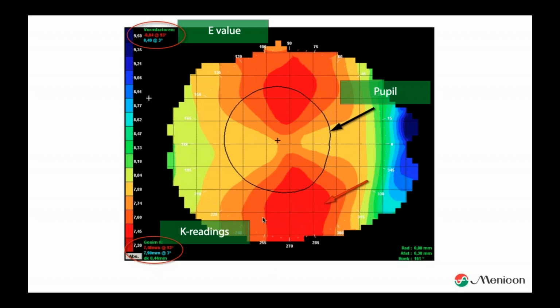Then there's another thing. Red means steep. The redder it is, the steeper it is, and the more blue, the more cold colors, the flatter the eye is. And you will see that I use a lot of Medmont images in this lecture. Why? Well, it's worldwide the most used topographer, that's for sure. But it is the topographer I use in my own practice as well, and that's for me the main reason, because I use a lot of images that I gathered in my own practice. But every topographer has in common that when it is red, it is steep, and when it is blue, it is flat. So you can always translate it to your own topographer.